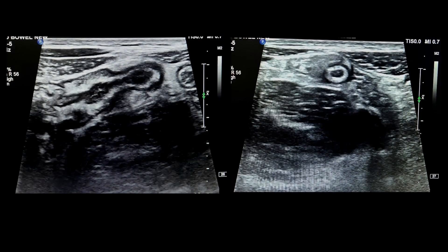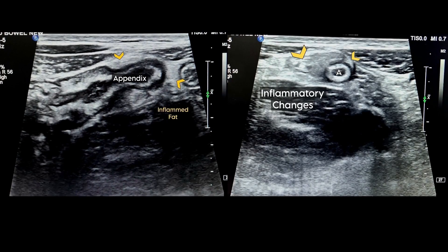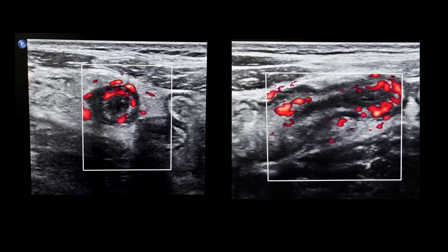Coming to acute appendicitis — as you can see here, there is a thickened tubular structure surrounded by echogenic fat representing inflammatory changes. On Doppler it shows increased vascularity. This was a case of acute appendicitis.